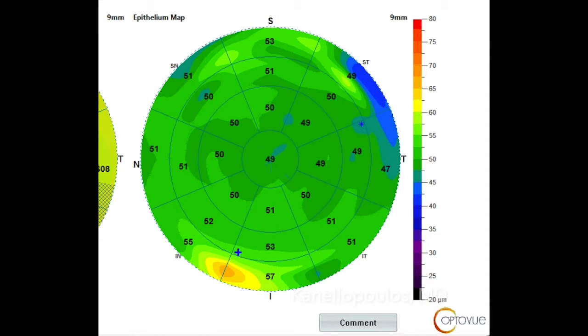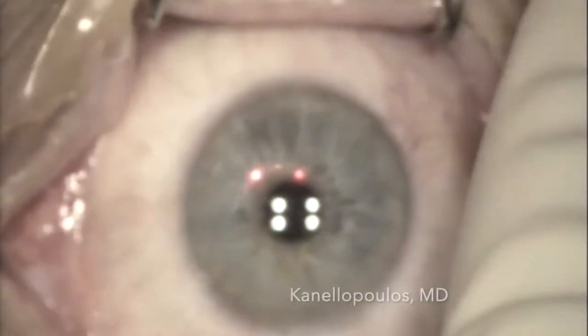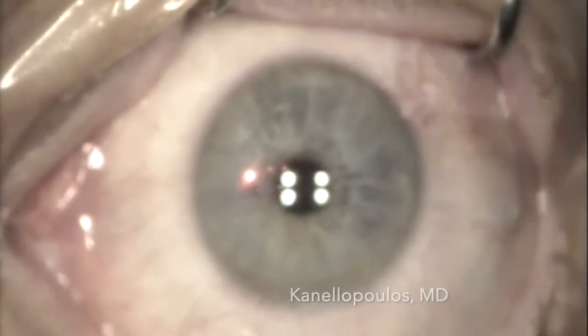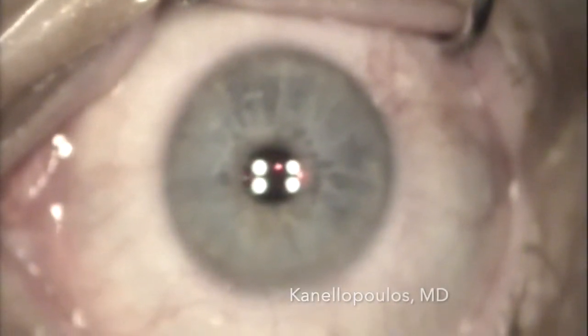We're going to do something very different here. Due to her dryness and trying to do a simpler procedure, we're introducing a minimally invasive hyperopic PRK, where the epithelial removal is calculated using OptoView maps — determining how much epithelium needs to be removed. We saw an average of 50 microns at a diameter of 6 to 9 millimeters, where the hyperopic correction with the laser is.